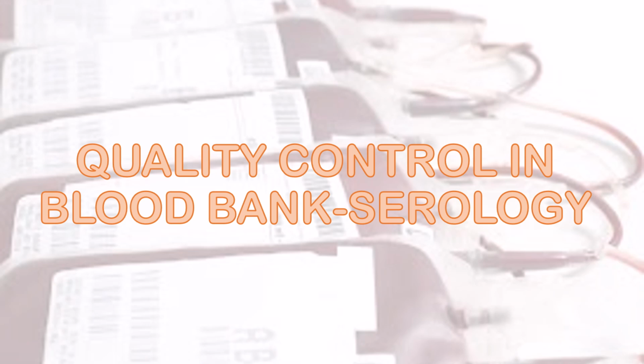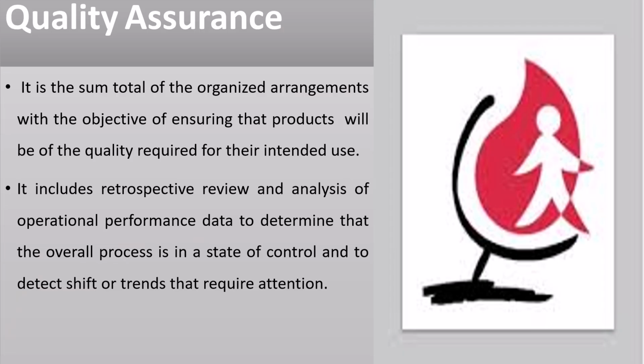Today we are focusing on the key part of lab accuracy, that is quality control in serology. Whether it is your blood grouping, antibody screening or TTI testing, quality control ensures your results are reliable, reproducible and safe for patient care. Let's get started. Quality assurance.